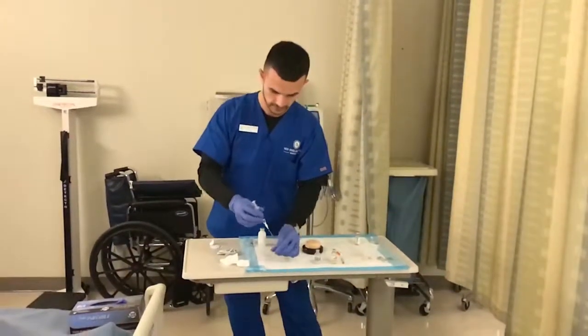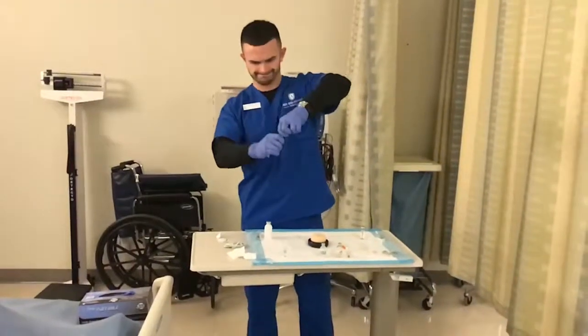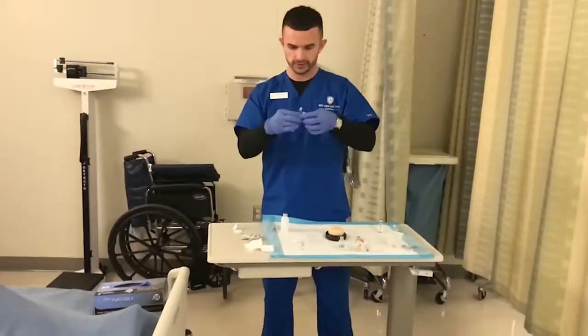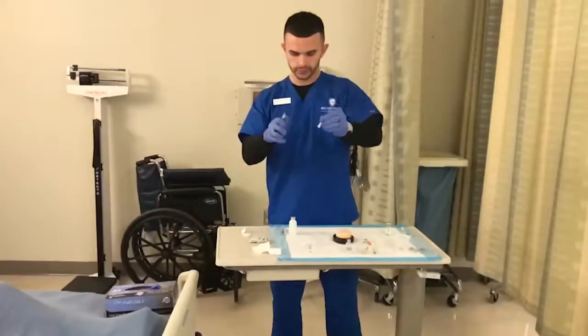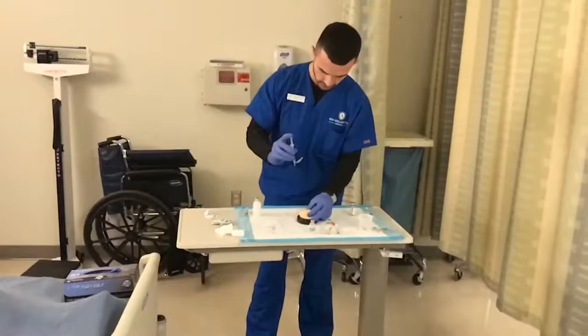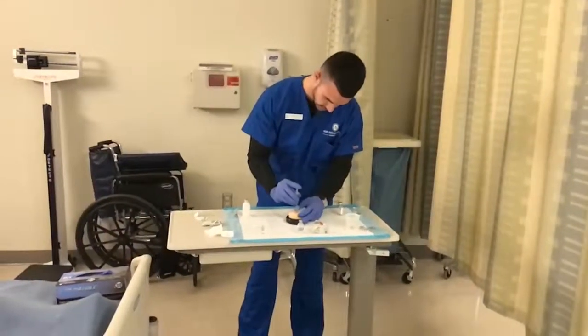Tip that over, and I'm going to remove my filter, and I'm going to insert my needle. Cap off, and again about a 45 to 90 degree angle, or pinch my patient's skin down and inject.